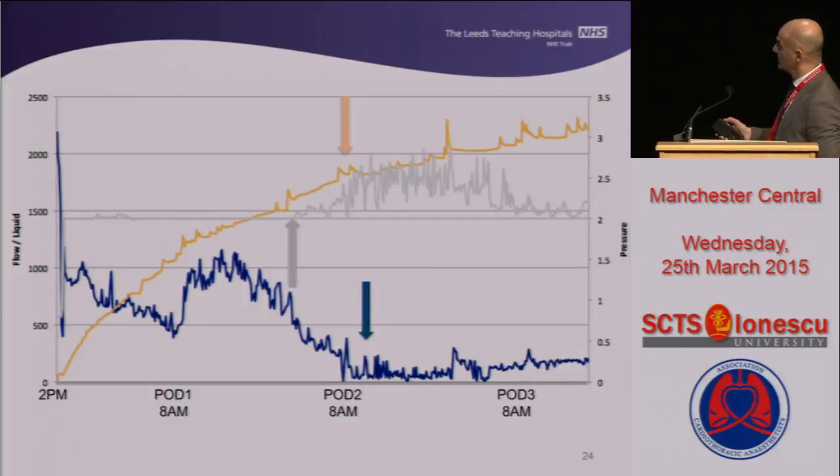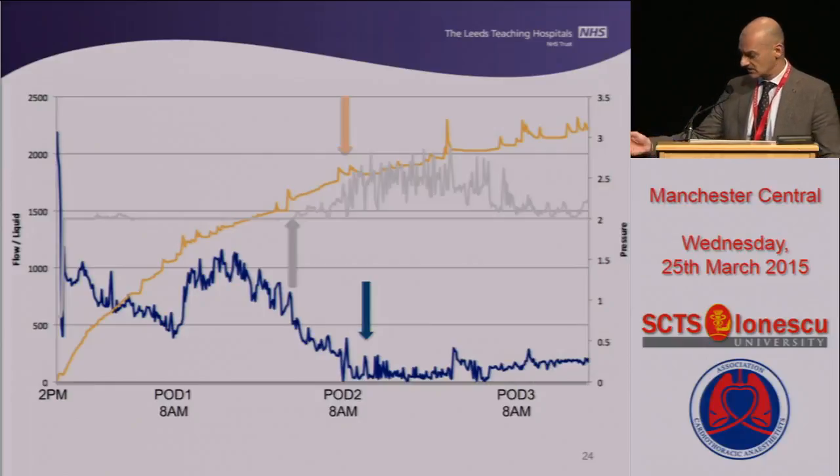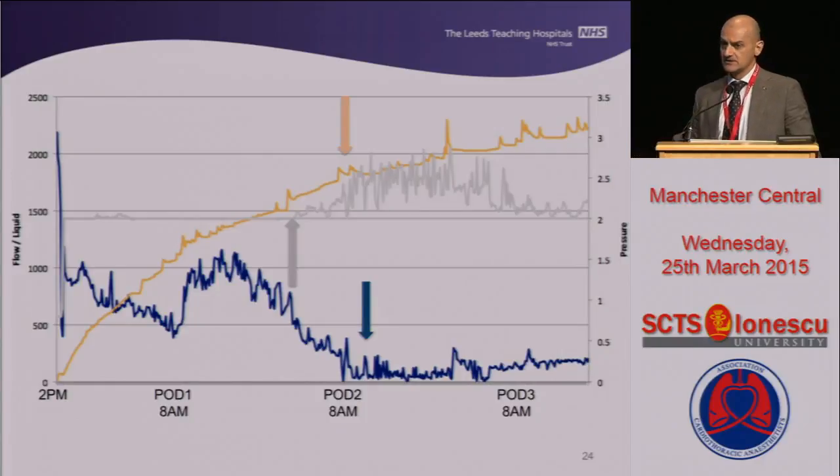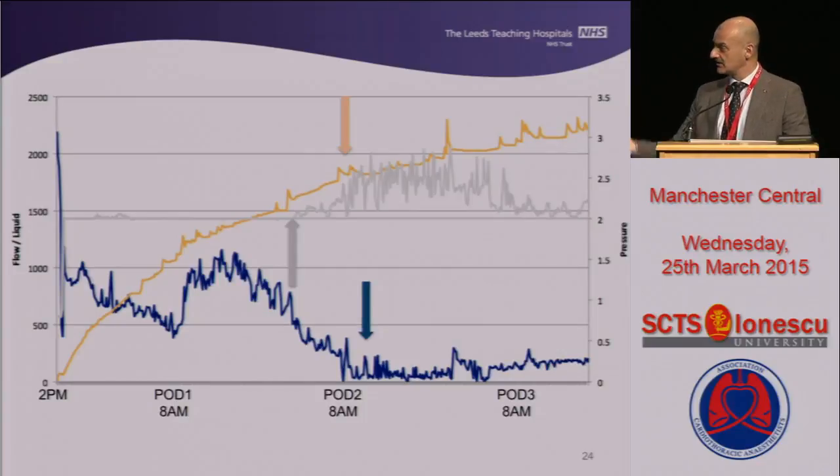And also, we can perhaps find a deflection point in the fluid drainage or fluid effusion that can help us anticipate chest tube removal. This type of graph is not used yet in clinical practice. We have devices that can give us the averages at the bedside. We are not yet able to use this kind of graph or integrate this information to find algorithms to establish when it is safe to remove a chest tube early. But I think this will probably be the future in chest tube management.